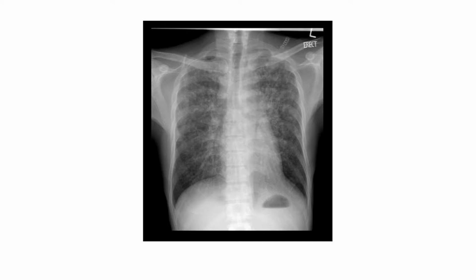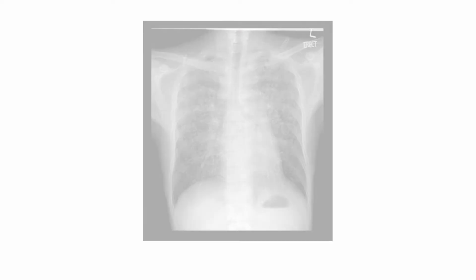Obviously, this is not a microscope, and we are not seeing a bug, right? We are seeing the consequence of a process that is blocking X-rays, and that process could be blood in the alveoli. It could be an inflammatory process with cellular debris and edema in the interstitium, blocking the airways in varying degrees, producing an image that we capture on film. So the truth, of course, is that when we see an X-ray, although we expect our students to say that bulging fissure sign is equal to Klebsiella pneumonia, the truth is that the X-ray does not give you a microbiologic diagnosis.